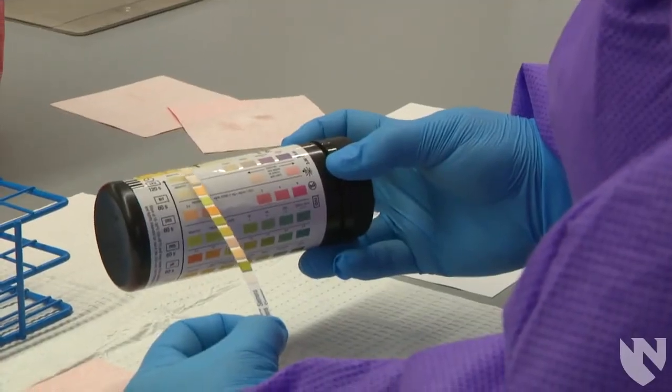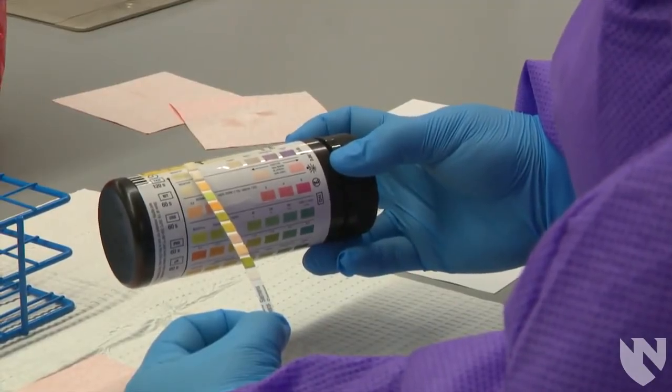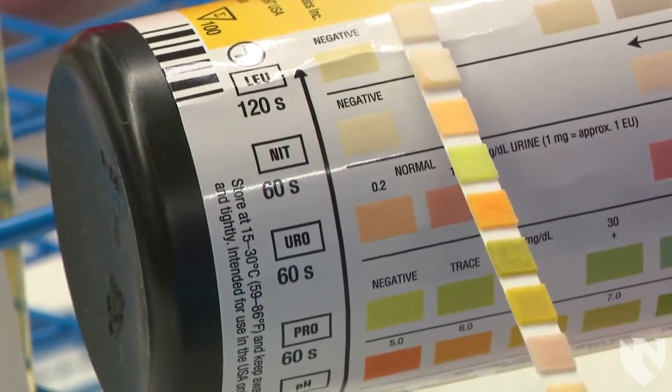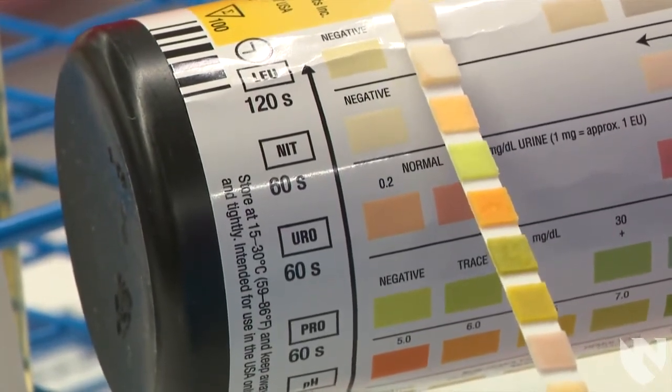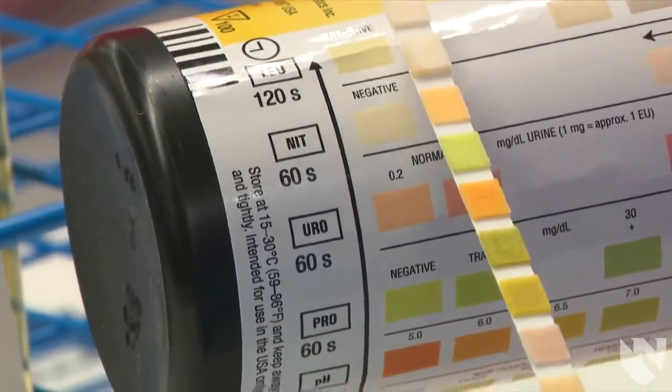The last reaction, leukocyte esterase, is read at 2 minutes, and we need to make sure to wait the full 2 minutes for that reaction to occur before we record our answer. If we read the reaction too soon, we could report a false negative. Here, our leukocyte esterase value is negative.